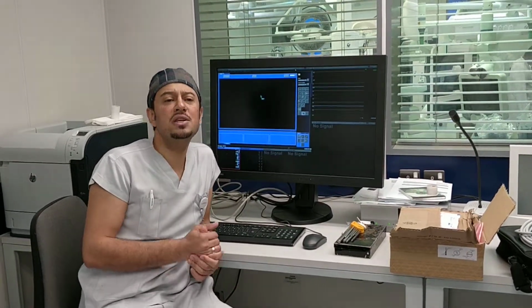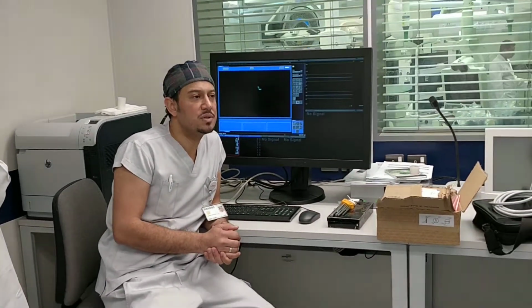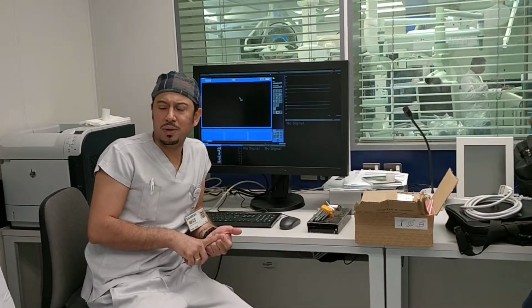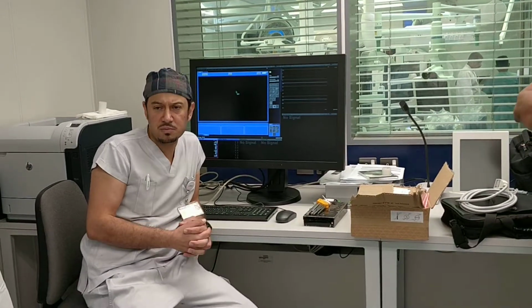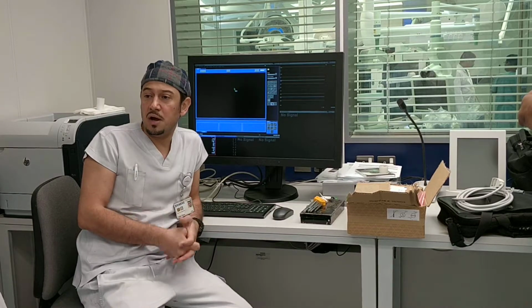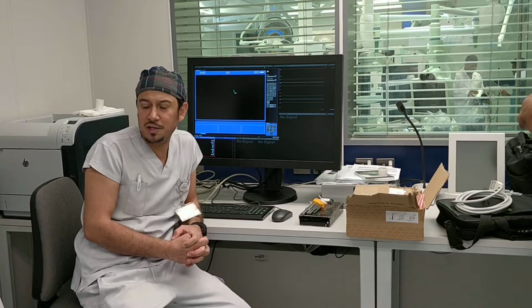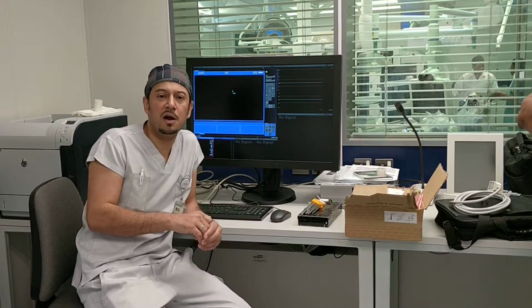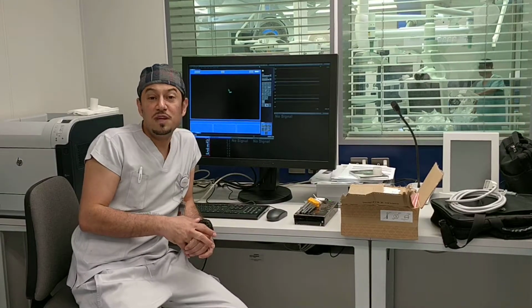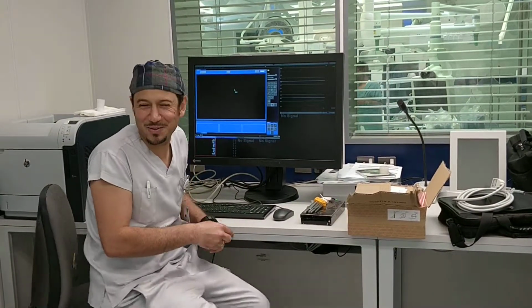They have a very similar concept when it comes to obtaining ECG, obtaining hemodynamics, showing calculations. The difference between them is the buttonology. For example, someone is used to driving a Volkswagen. I love my Volkswagen. I know where my buttons are. I know the speed of the car, and I know everything. Suddenly someone hands you a V12 Mercedes. That's a big difference, right? A big smile on your faces.